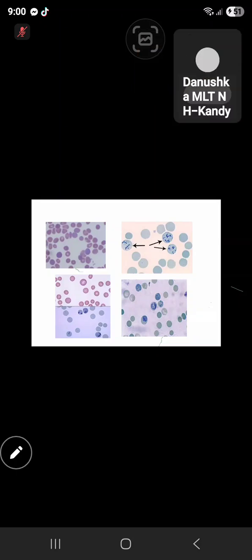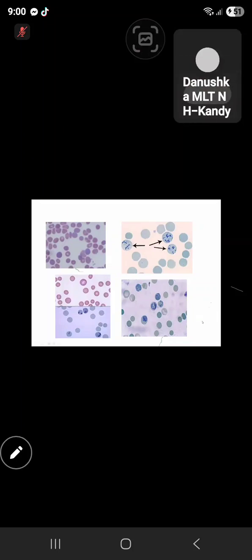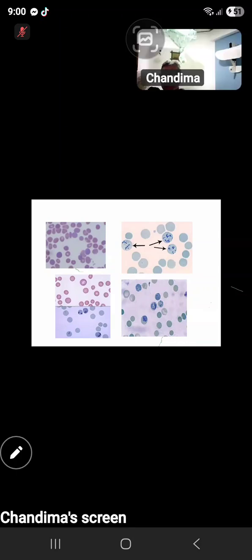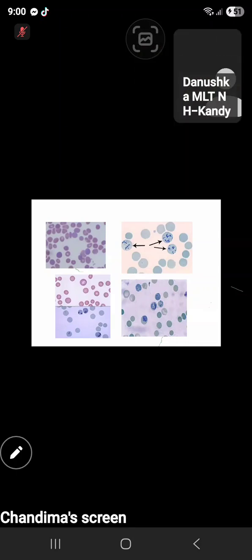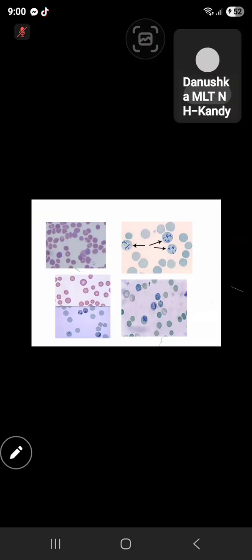Another question. In the case of infants and immature babies, what would be misleading? They may present NRBCs even. I didn't get your condition. In case of which condition? I'm asking regarding infants and babies. What are the misleading conditions where we can't exactly say whether it is an NRBC or a reticulocyte? How would we count them?